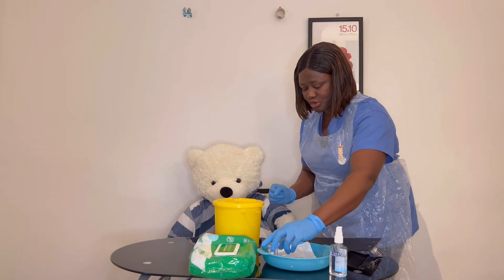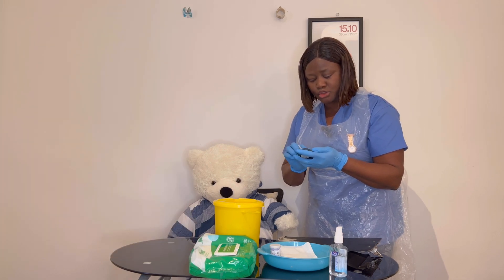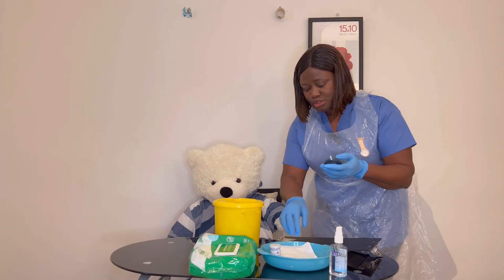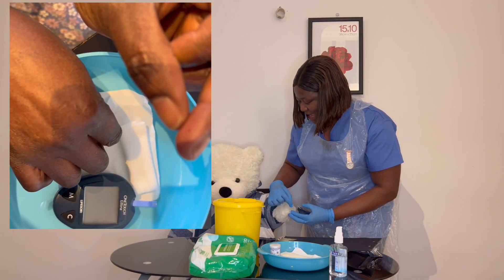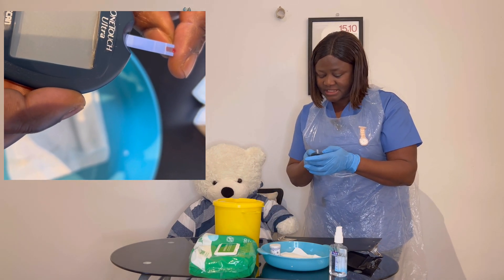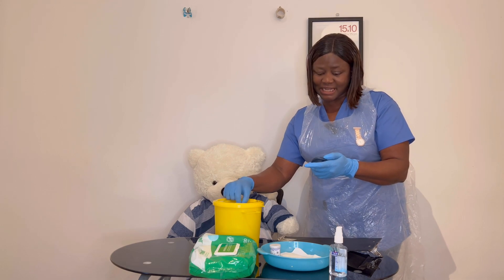I can confirm the finger is not visibly soiled. I will take the glucose strip, put it in the glucometer, and wait for the sign that it's ready for a drop of blood. It has given me that sign. I'm going to use my lancet to prick your middle finger — a short scratch. I've pricked that and I'm taking the blood sample. The blood glucose reading says 5.2, which is a normal blood glucose level. I'm going to discard the lancet and the glucose strip immediately into the sharp box.